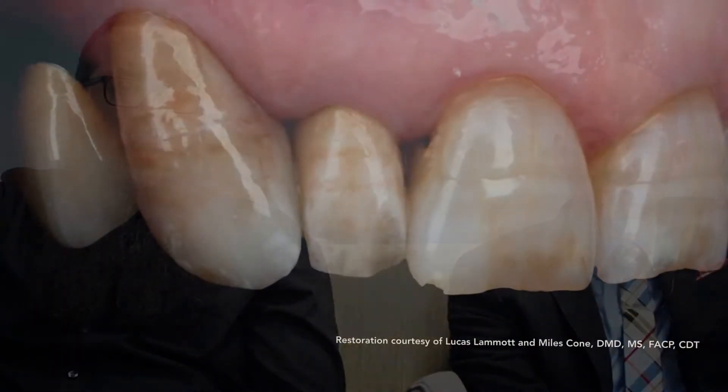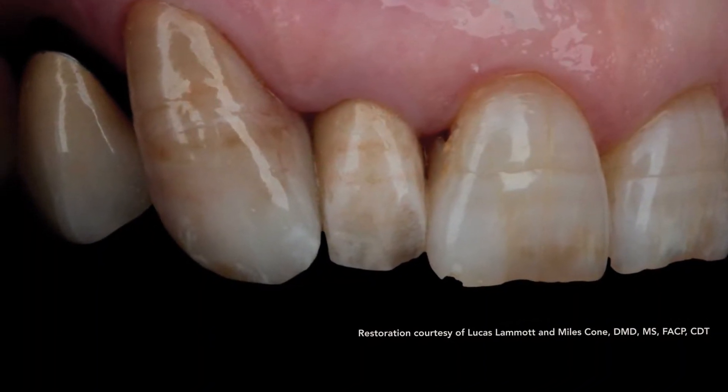It's nice having a seamless system. The coherence between the Lissy press and the Lissy ceramic — there's a synergy happening there that's really cool. And the real difference is the vitality: it looks a lot more vital, a lot more alive in the mouth. It doesn't look dead.